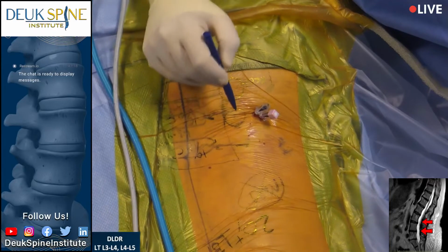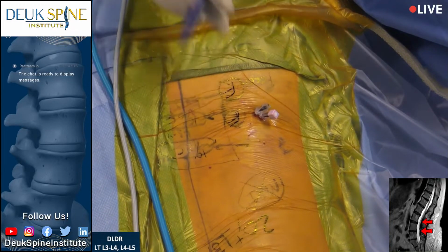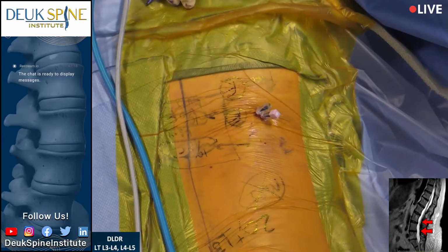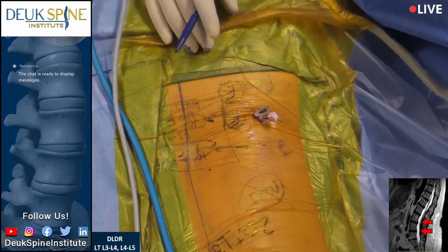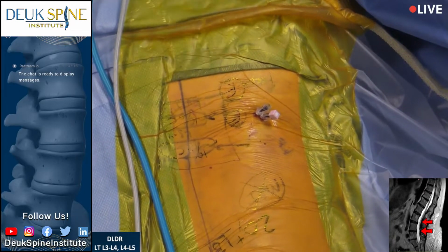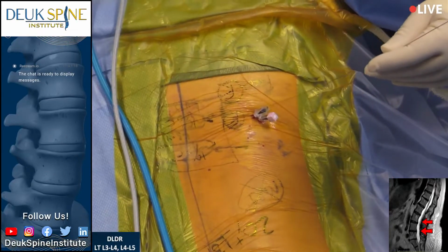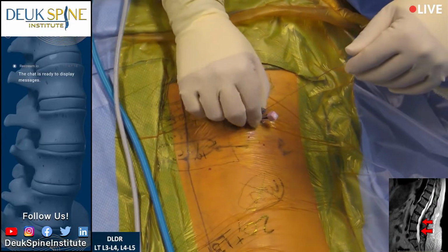What we didn't test is the facet joints, right? But we know these are painful because on exam, when I checked her out, I mashed on them and they were very tender. So I believe the L4-5, L5-S1 facet joints are also causing pain. But the discogram doesn't test for that. It only tests for disc pain. All right. Go ahead and type up questions while you're watching the surgery if you have any. Meanwhile, we're going to keep going.